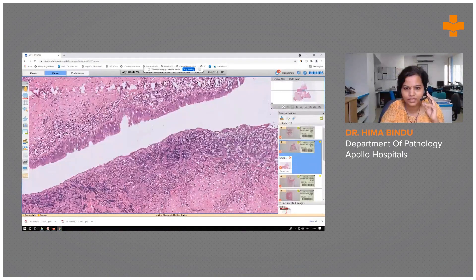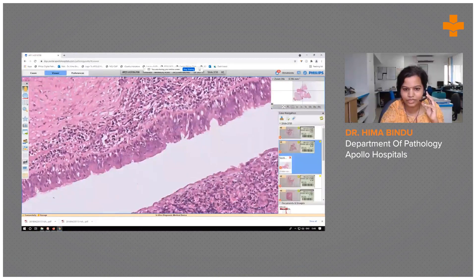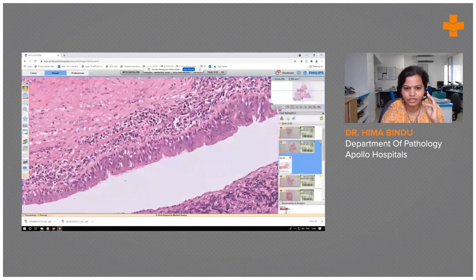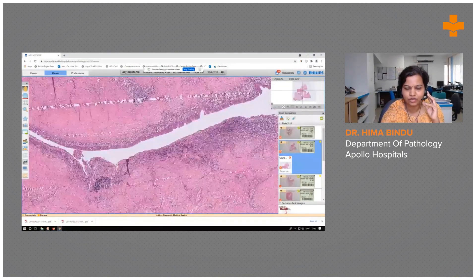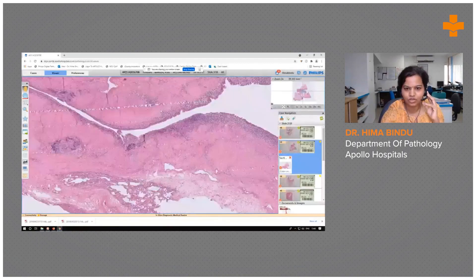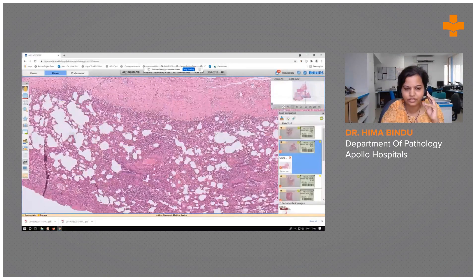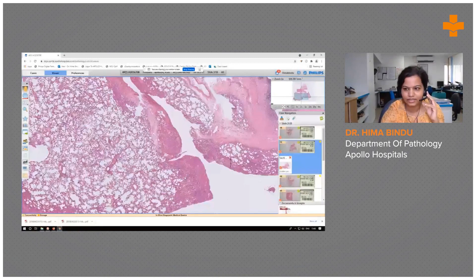On a higher power view, you can see the respiratory bronchial epithelium, which is pseudostratified columnar epithelium with dense inflammation. The fibrocollagenous wall and the adjacent lung parenchyma appeared very busy with a lot of inflammation, with normal-appearing lung parenchyma beyond that.